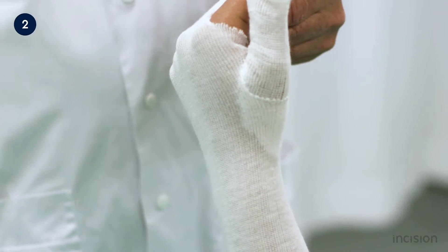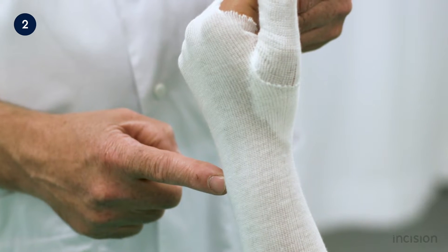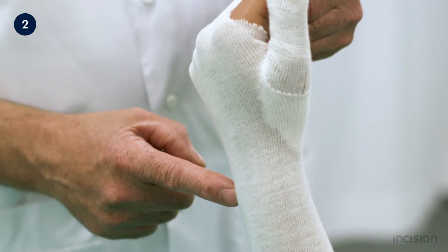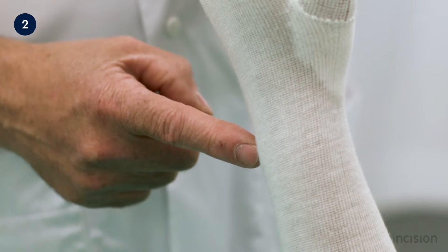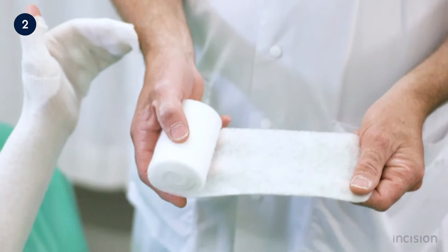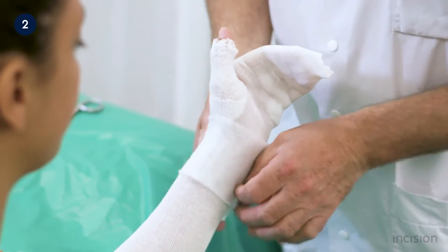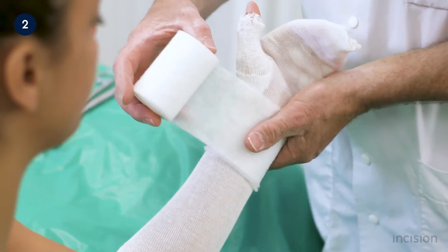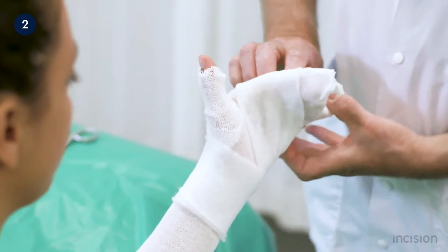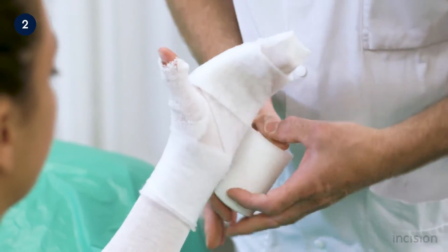Padding is then applied, with extra padding over the ulnar prominence to avoid pressure complications. Too much padding should be avoided as this may cause the splint to be too loose and move over the arm, leading to scratches or blisters. The flat part of the roll is applied onto the limb for easy unrolling, starting at the wrist joint with two turns and then two turns distally over the digits to be included in the splint.